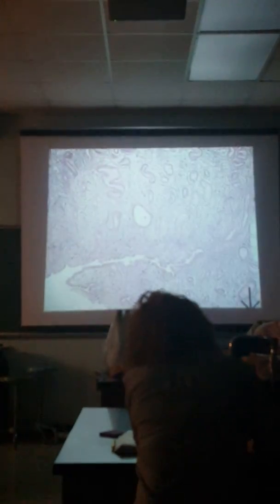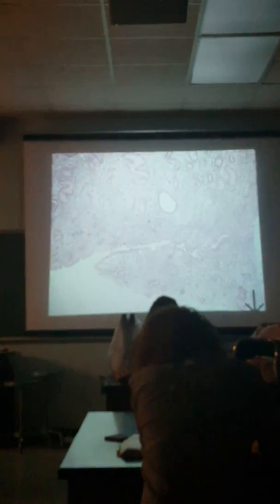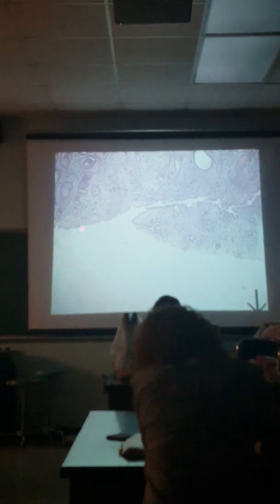So here we have endometrium. See, look at this, so this is where the egg would implant. So this is inside uterus. And then we've got all this. This is all endometrium. And then that's myometrium. But you'll notice endometrium looks very, very developed.